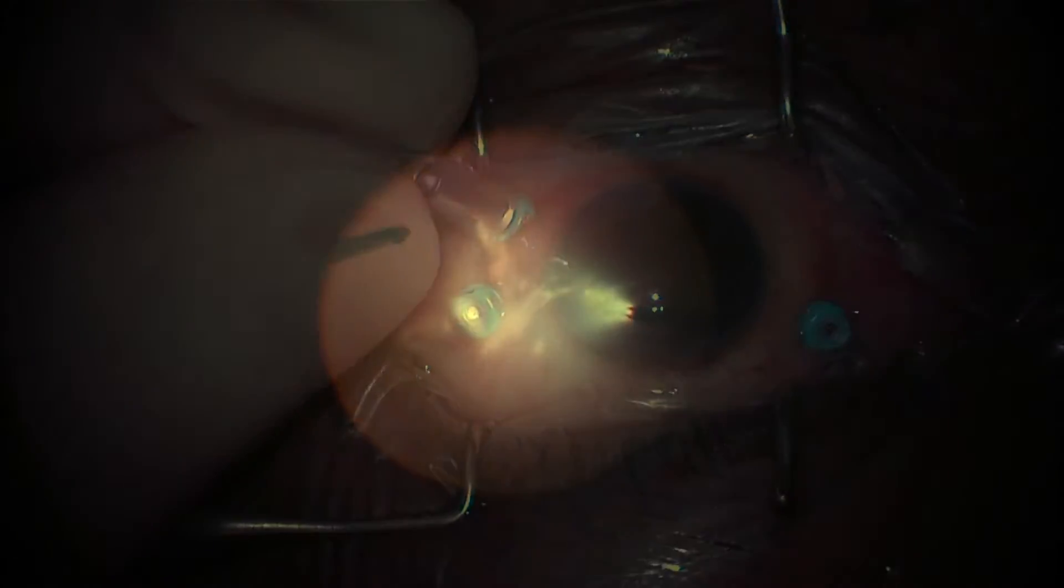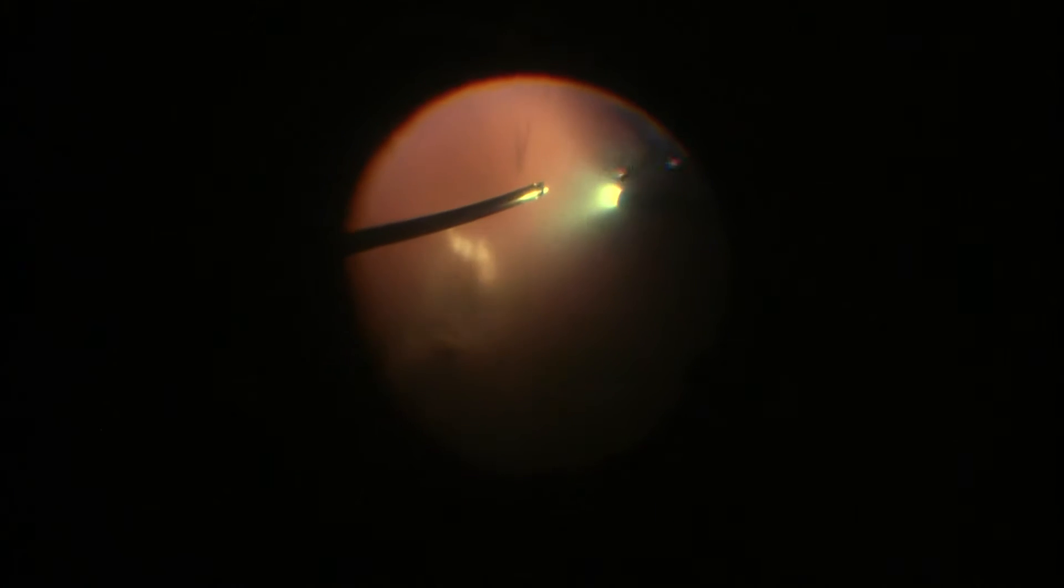Here you see that we're engaging the infusion in the inferior temporal port, and we're going to start looking inside. Right away, we're going to notice you can't see very much. There's a dense vitreous hemorrhage over here that's obscuring the view to the retina. And so just like we can't see directly to the retina, the patient's not going to be able to see very much out of this eye as well.